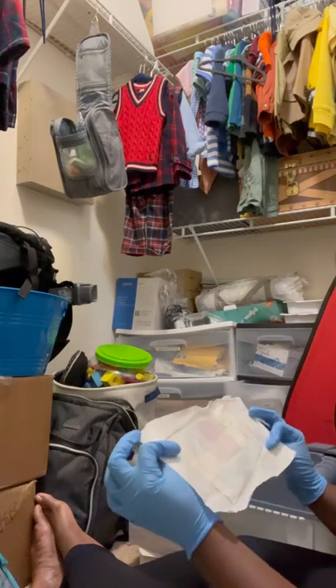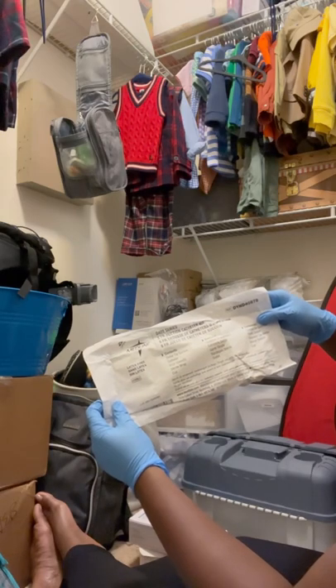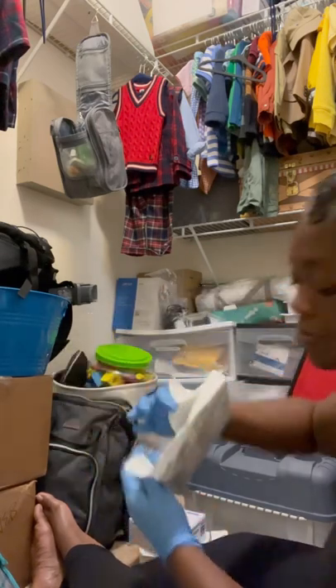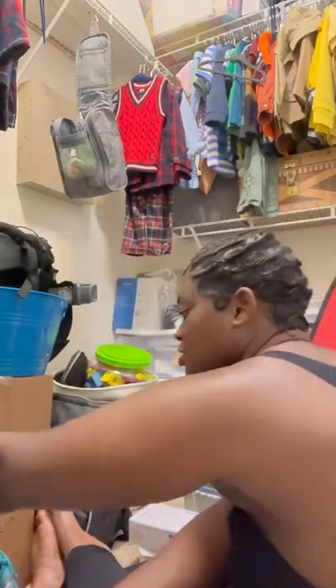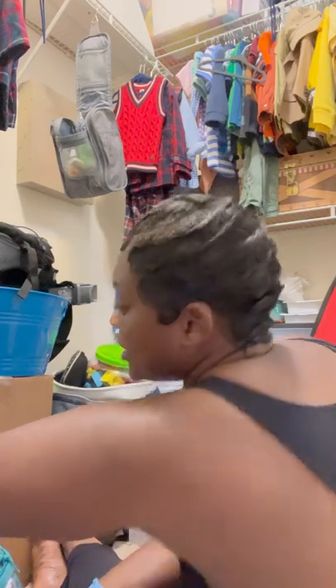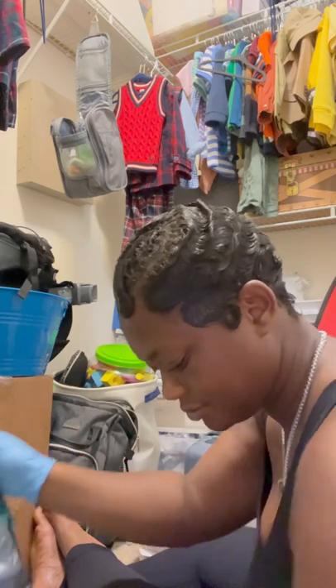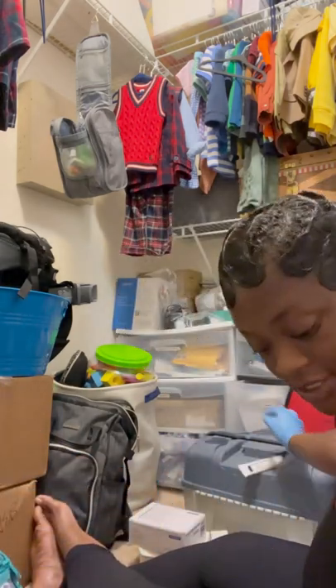Oh wow, I never had to use this — I don't even know how to use this. This is an 8 French suction catheter kit. I've never had to use it, but I will keep it packed in here because you never know what may happen in emergencies. And I'm also going to add the suction catheter that Braylon does use in here. This is Vaseline — that goes in his diaper bag.